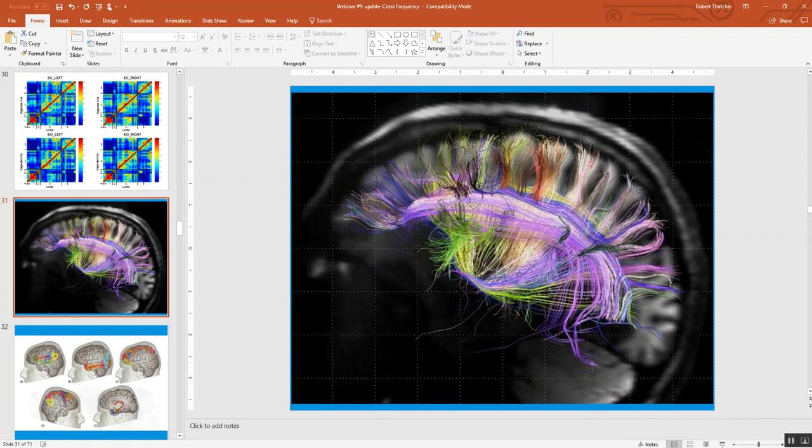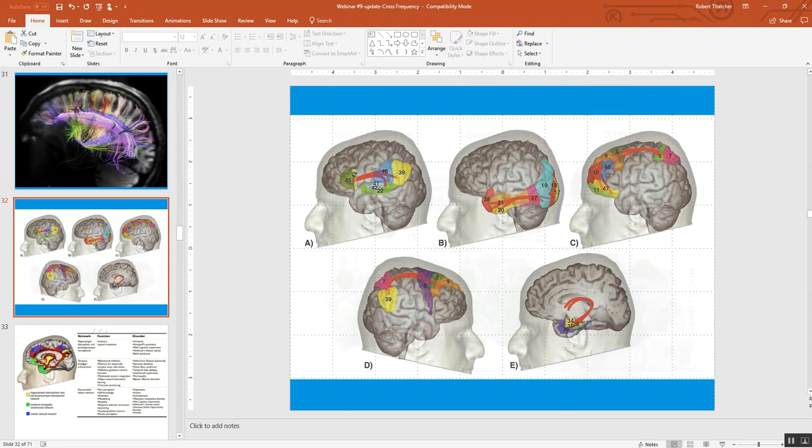And this is diffusion tensor imaging. It's a beautiful image. It shows you the U-shaped fibers up here that are connecting up different clusters. And then you get the long distance fasciculi, the frontal occipital fasciculus, the arcuate fasciculus, etc. So you've got both short distance and long distance organization. And sure enough, the EEG replicates this fairly well.